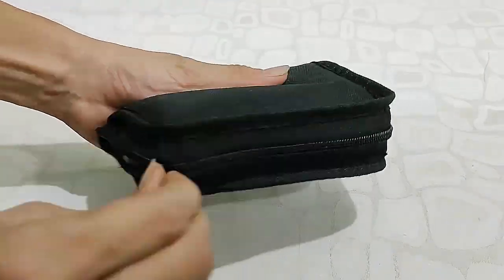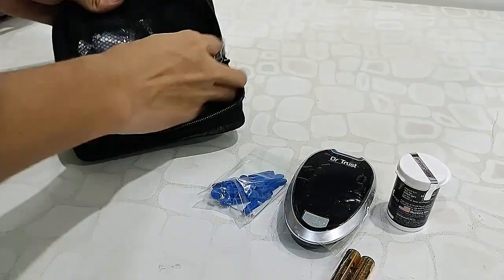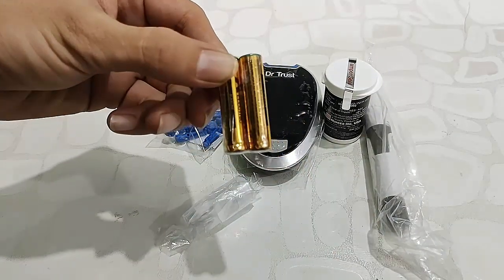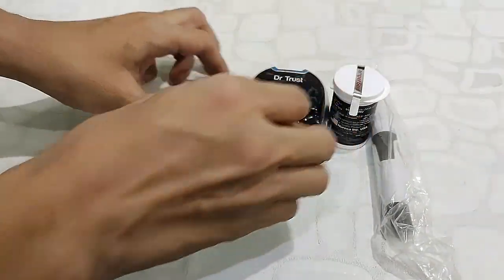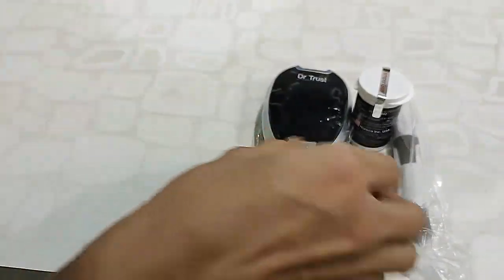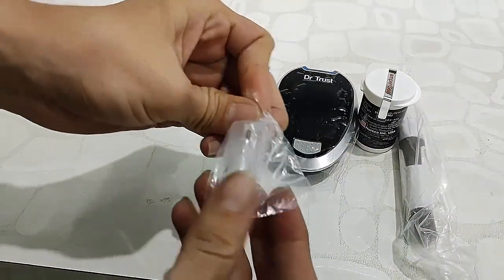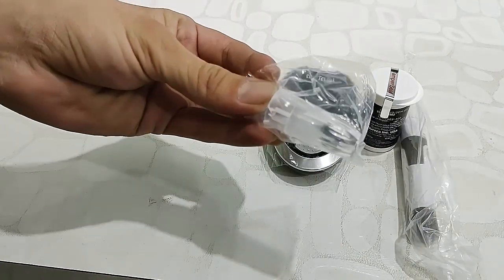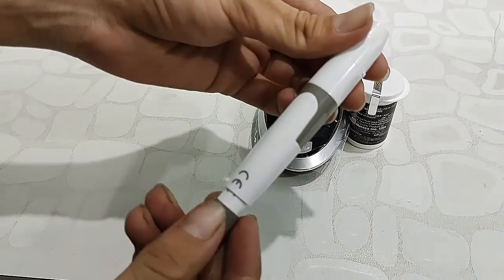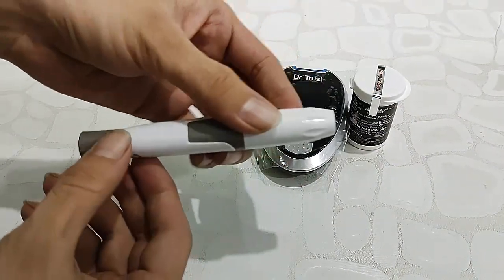Now to the main things — the glucometer comes with a nice carrying pouch and all accessories. There are two triple-A batteries, a lancing set, lancet needles, a lancing device, and an additional cap. I'll show you how to use the lancing device.